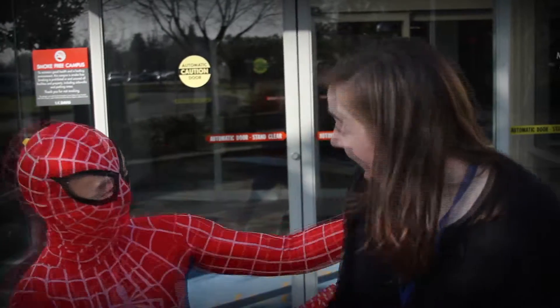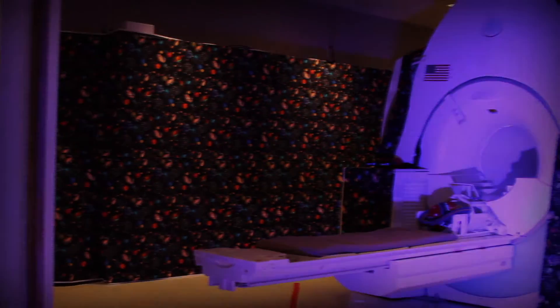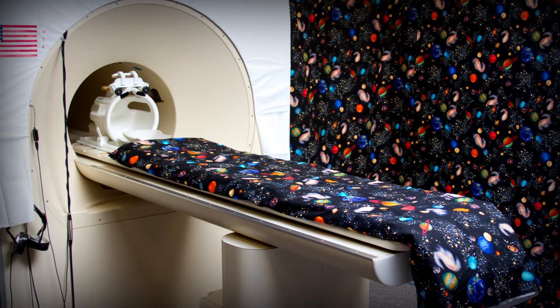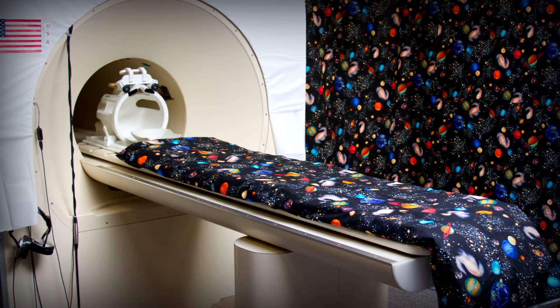Hi! Today I am here with Spider-Man. We are here to show you how we can take pictures of your brain in our MRI spaceship. First you will train with the practice MRI spaceship. This is the room where you will meet people from the space team and learn how to get ready for your MRI space mission.